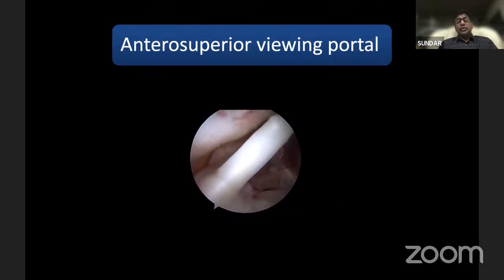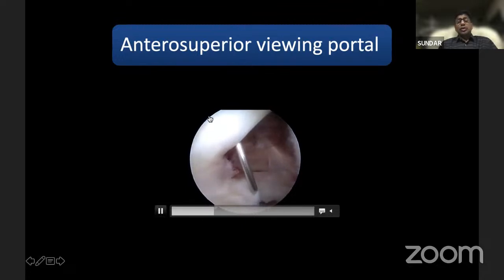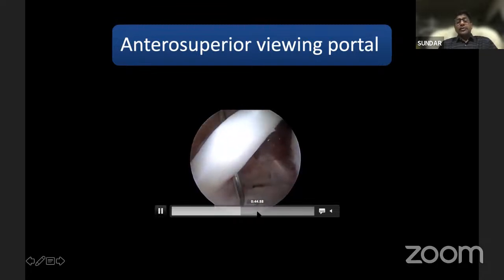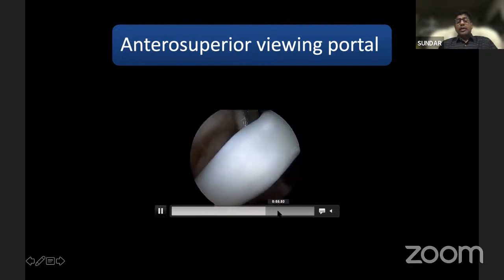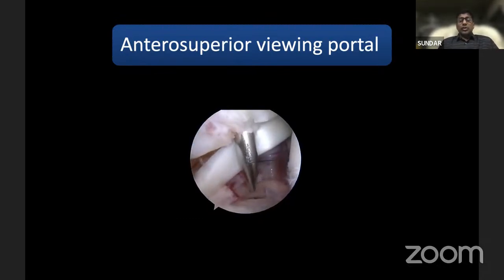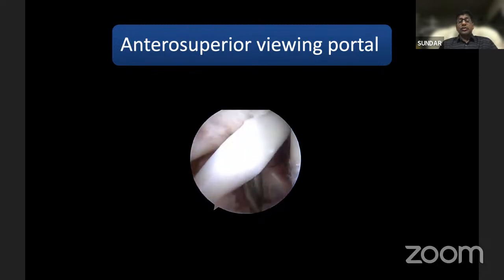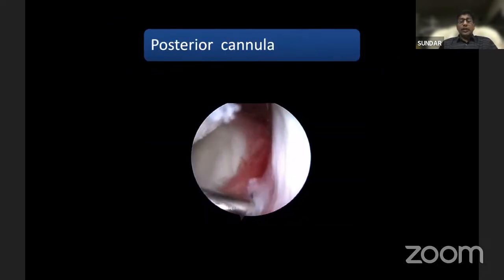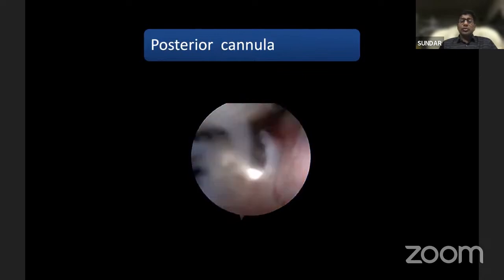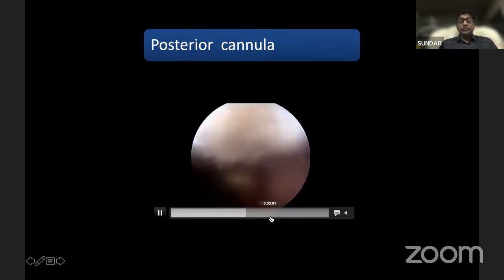You just insert a needle. So you can see that is a white part, which is the supraspinatus. So you try to go still in the rotator interval. That is an easy passage so that you don't damage your anterior supraspinatus cuff. So you just go anterior to the biceps. But once you make the nick and insert the scope, it can come again lateral to the biceps, so that it prevents the crowding of your scope and your anteroinferior cannula, so that you don't have any back out of your anteroinferior cannula, and you don't need to touch that. So you can move your scope to this side or that side. Then posteriorly you insert around a 6 mm cannula. That is going to be mostly for the suture management, especially when you're doing the anterior instability repair.